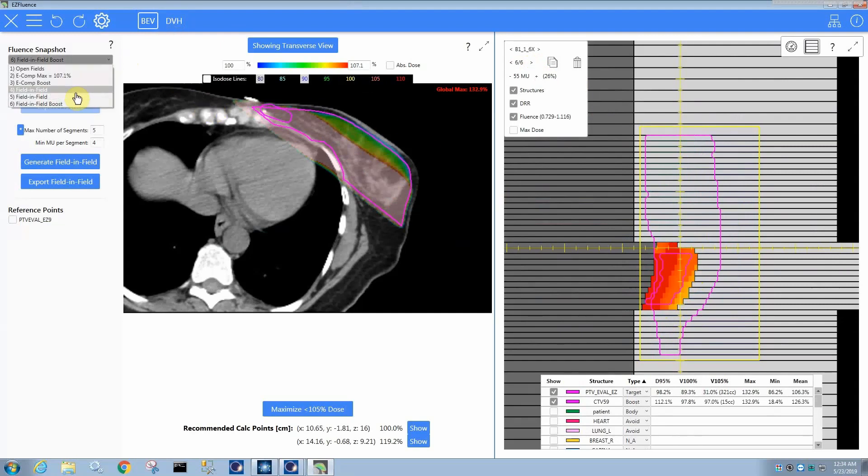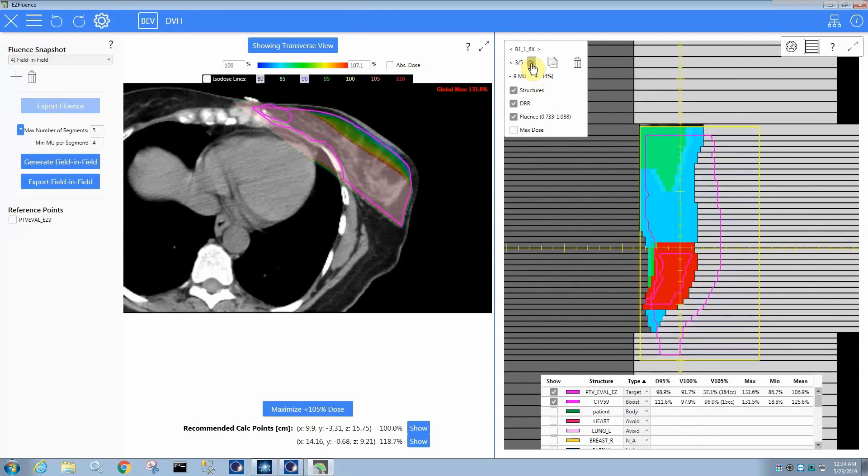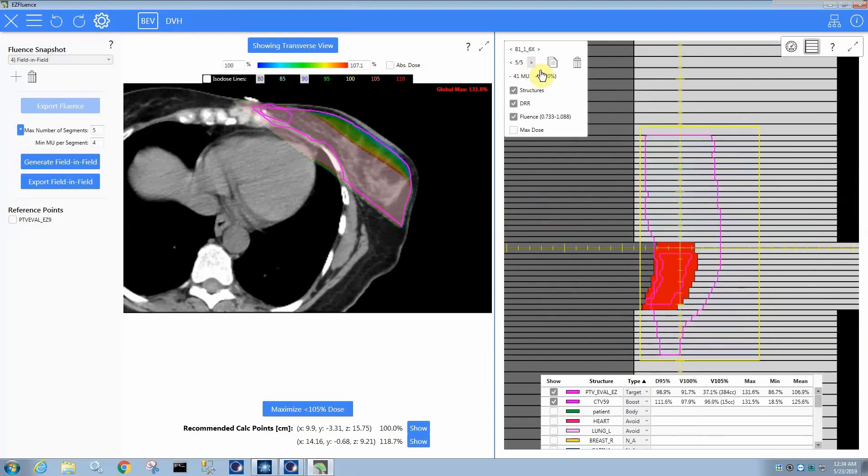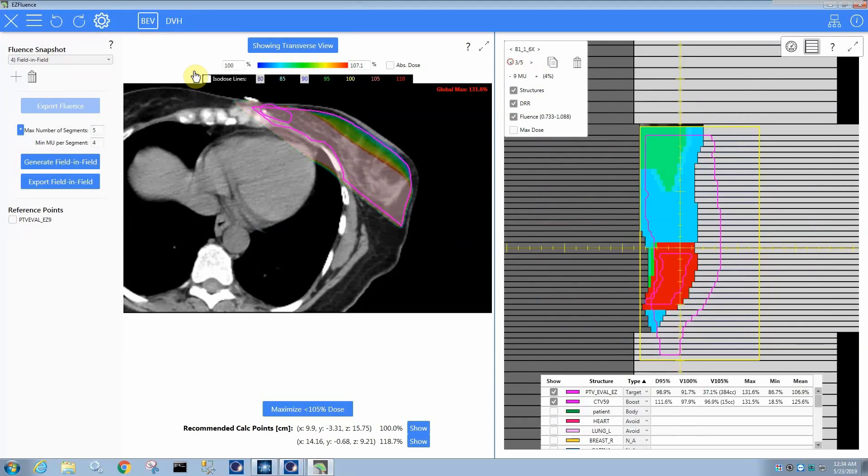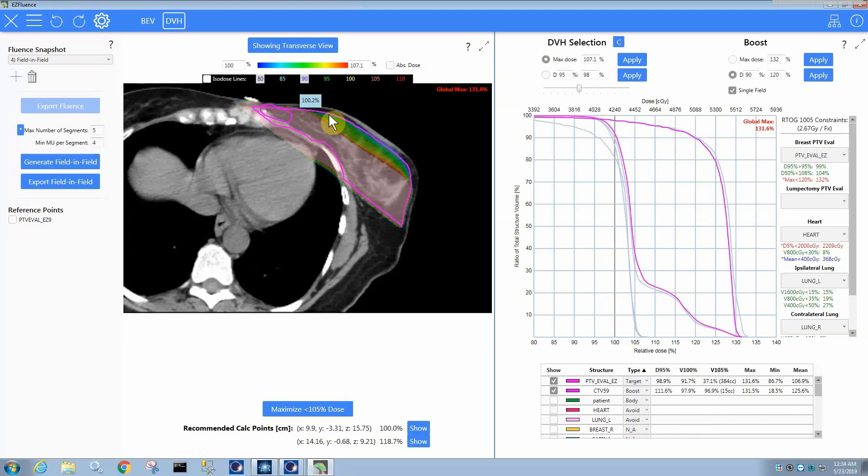So, yeah, slight difference. I don't know. It might actually be better to have done the field and field in this way. You have one less subfield potentially, but maybe that's not quite as good of a dose distribution. So, in any case, the point is that you have a couple options of how you can do your boost for field and field. You can either do the e-comp boost and then sequence or generate the field and field, or you can generate the field and field first and then do the boost and it will add a subfield. So, but essentially that's all there is to the boosting process.